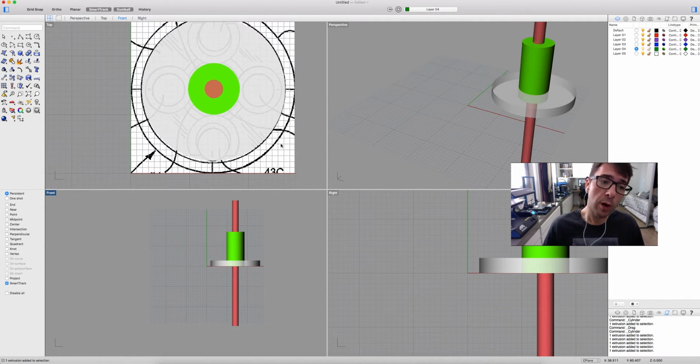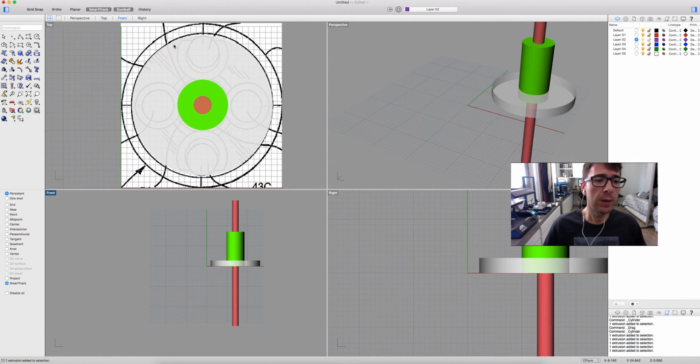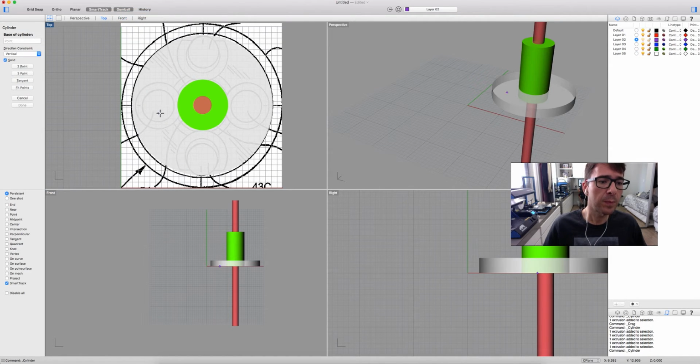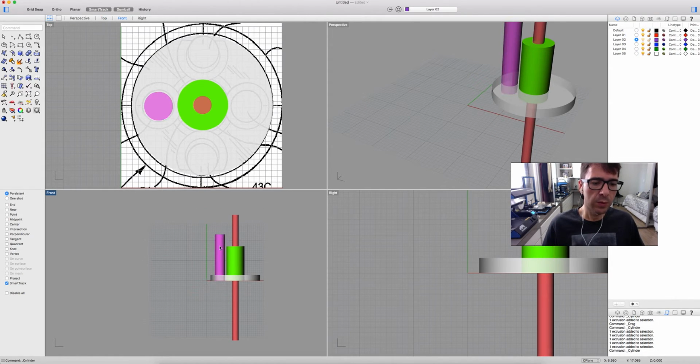And now we can draw, if we want, the screws. Let's change colors. Let's draw a screw, cylinder. Let's select in the middle. Let's draw here. We can choose the correct diameter of our drill if we want, but we are designing here in a quicker way. So let's draw the screws.